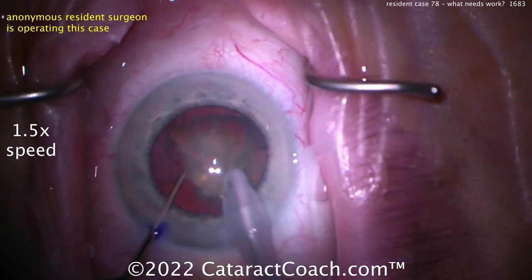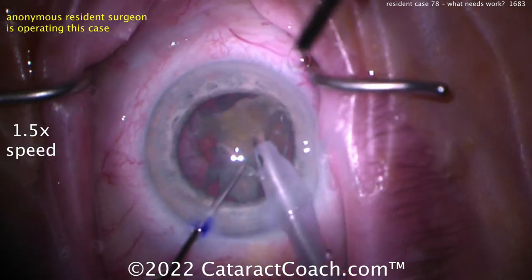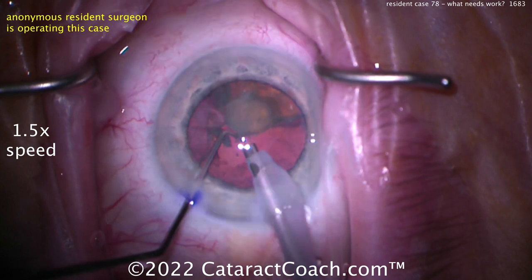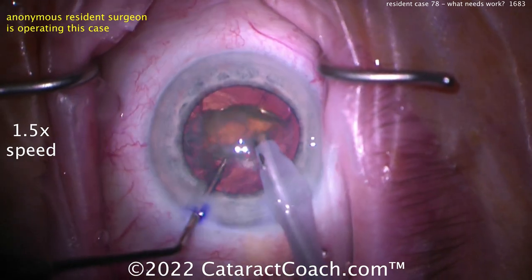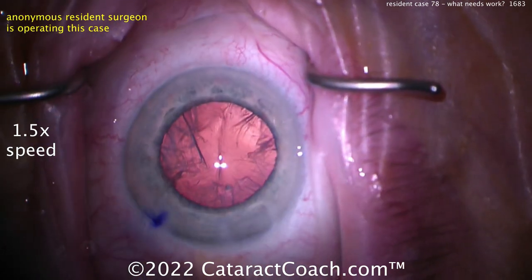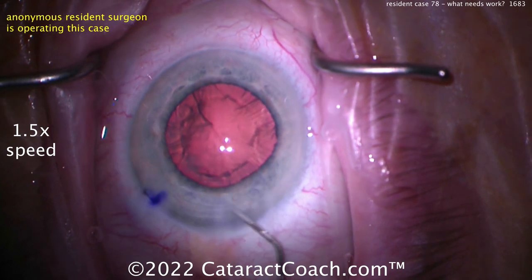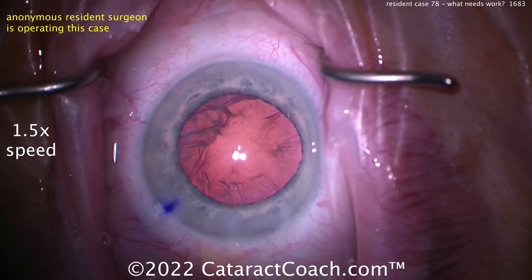Go to the immediate part of the nucleus. Remember the nucleus is thicker in the center and thinner towards the equator of the lens, so don't try buzzing that lens equator — it's softer, less dense, and you may buzz through the piece. I like that you went back to the apex of that quadrant, which is the center part of the nucleus — denser and thicker. Chopper in that safe position — very nice. Coming out of the eye, the incision hydration looks pretty good. A little sweep there of the angles — I like that.